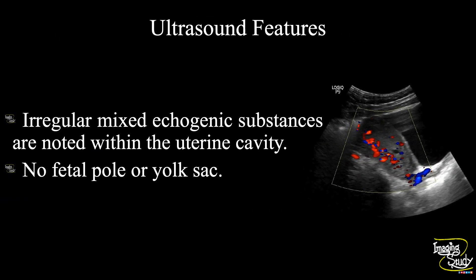So in summary, irregular mixed echogenic substances are noted within the uterine cavity without any fetal pole or yolk sac, suggesting retained products of conception.